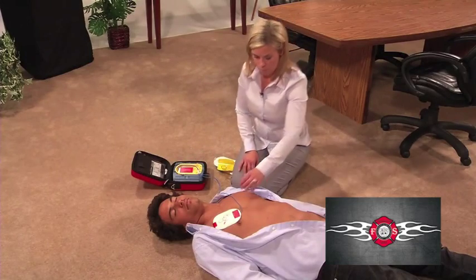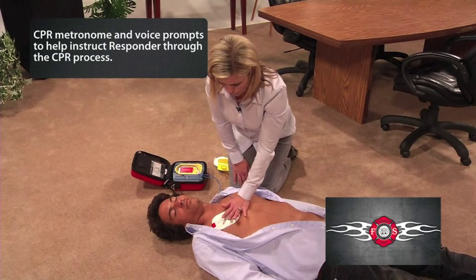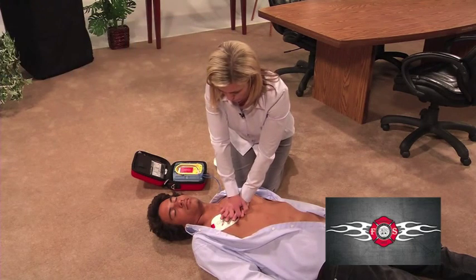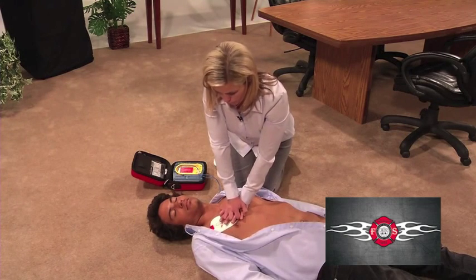Place the heel of one hand in the center of the chest between the nipples. Place your other hand on top of the first. Push the chest down firmly two inches and keep time with the beat.